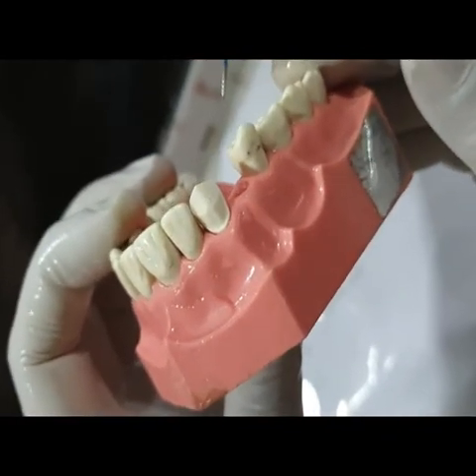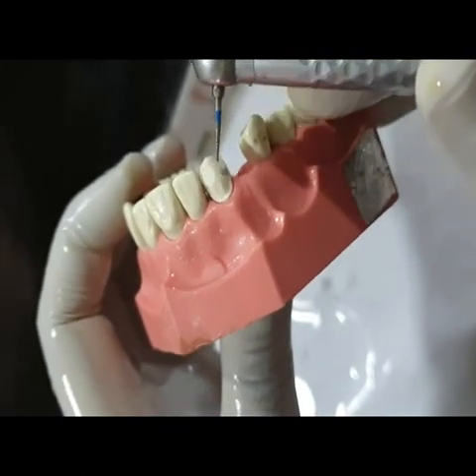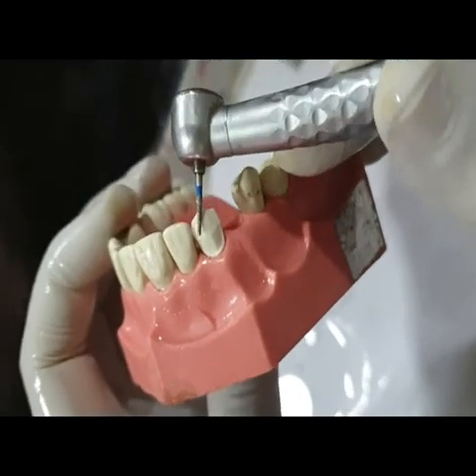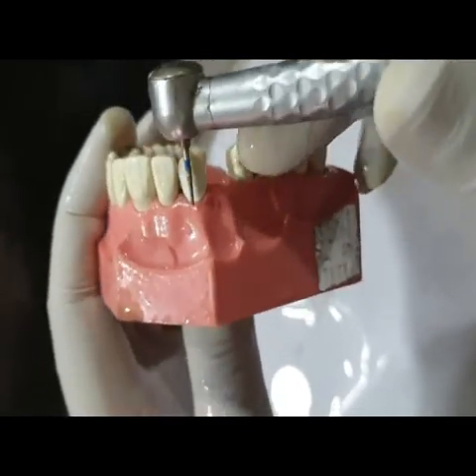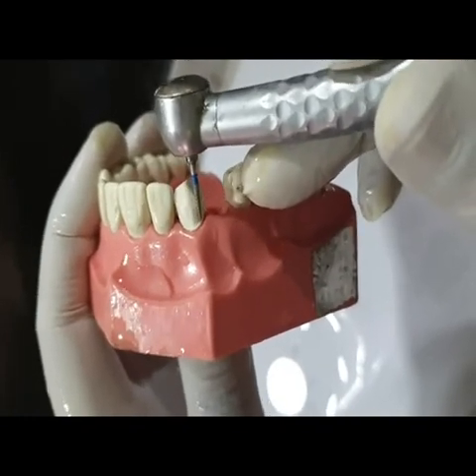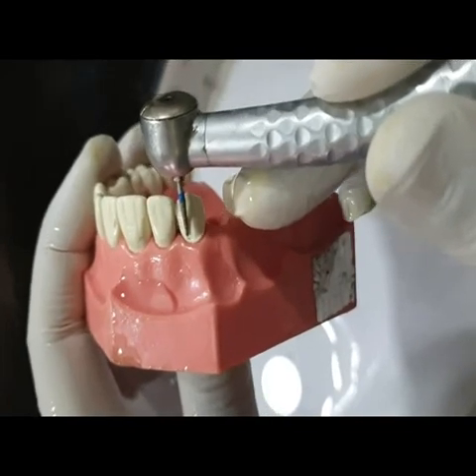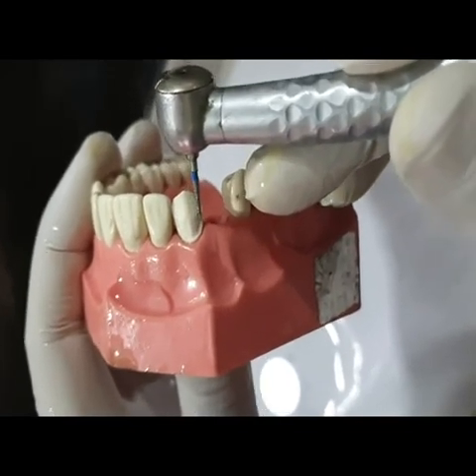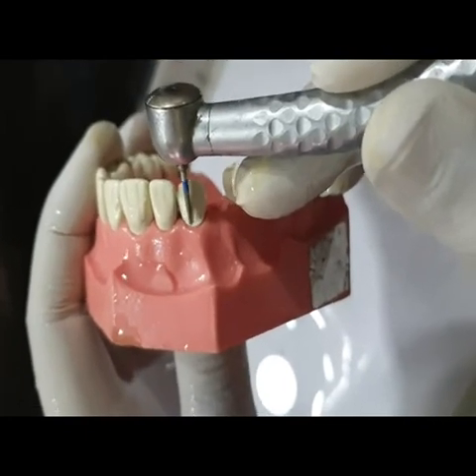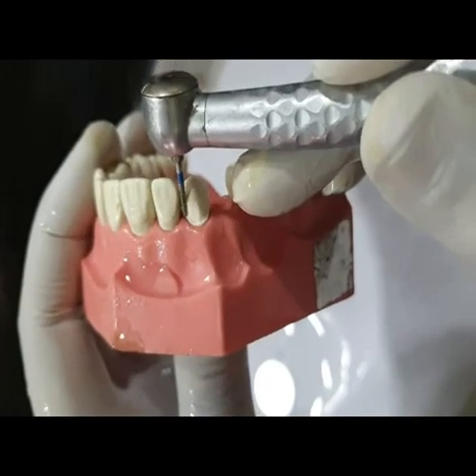Can you appreciate the thin line separating the two parts? Above this line, reduction has been done at an angulation, and in the lower cervical one-third, the bur is kept parallel to the long axis. Also, as I go to the proximal areas, I raise my bur slightly to get proper margins.